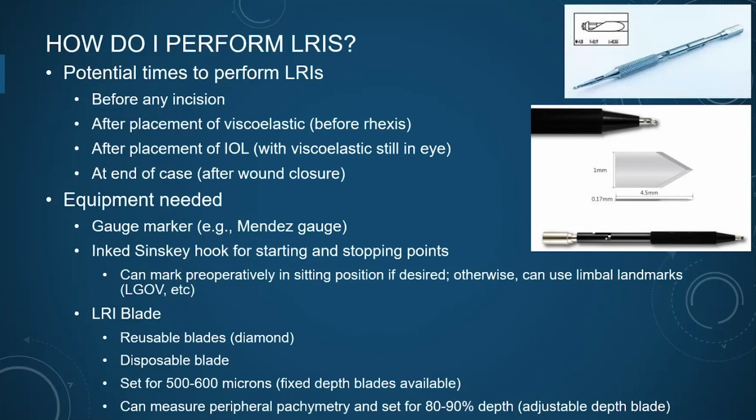Again, I think some of the Precision Lens folks will talk about the options there. These are really good options for surgeons who don't perform these a whole lot, or operate in a facility like a hospital-based ASC, or some people just like disposable blades more than diamond blades. Basically you can use any of these.